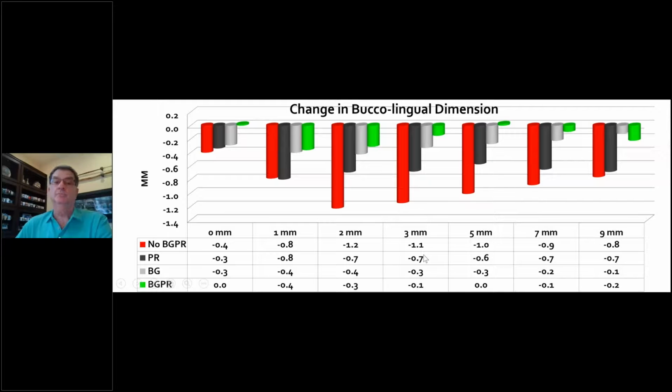That's not 1 millimeter, that's 0.1. Our averages were that small. It was that minimum change. It was really quite amazing to us that we saw this change. So it's only a millimeter. All of these are within a millimeter, but it's not 4 millimeters. There's no longer 3. What's the key? Palatal placement of the implant. There's a gap there. We filled the gap, ideally with the bone graft, and this is all different types of bone graft in this particular study. It was not restricted to one type.